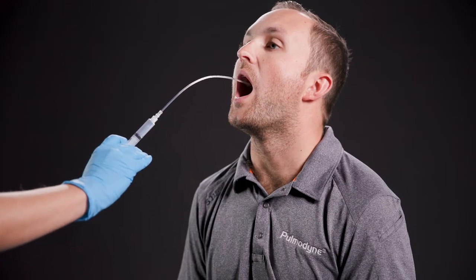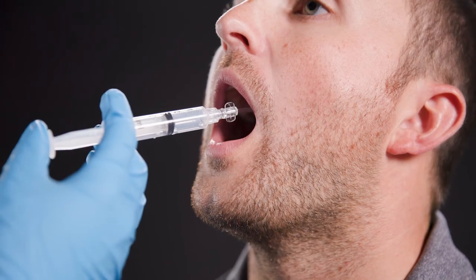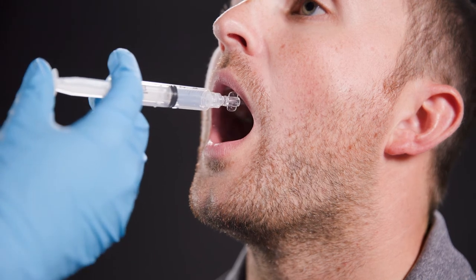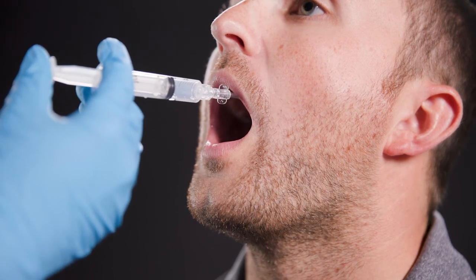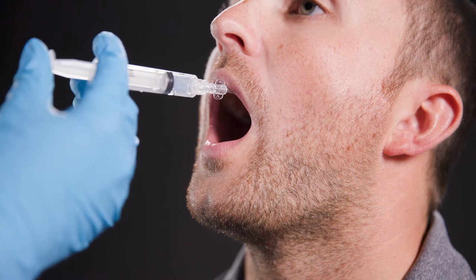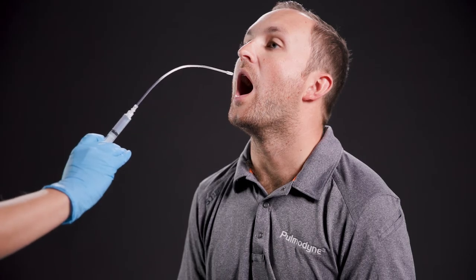Bend the DART Reach stylet and gently pass it into the mouth beyond the uvula, aiming towards the glottic opening. Compress the syringe and atomize multiple small volumes. Retract the dart and once again wait an appropriate time for the anesthetic to take effect.